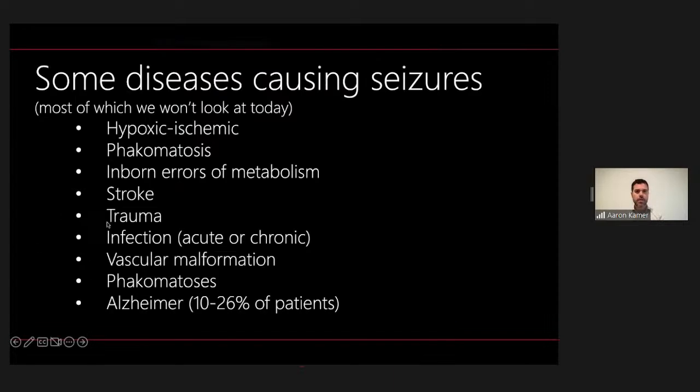Nice. All right. So we looked at a lot of the things that are associated and kind of incidental when it comes to epilepsy, a lot of those imaging findings. Holy cow, are there tons and tons of imaging findings that can be seen with epilepsy, many of which cause seizures and are seen easily on imaging, many of which aren't.